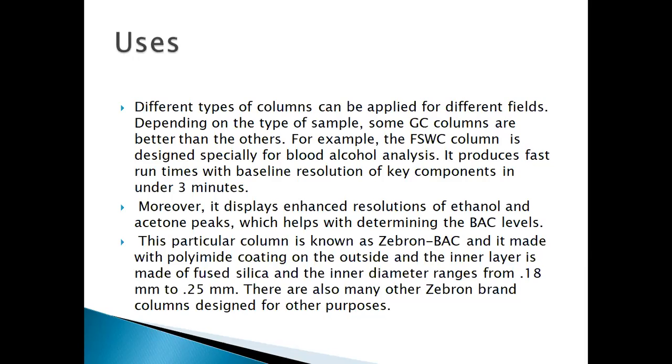Moreover, it displays enhanced resolution of ethanol and acetone peaks, which helps with determining the BAC level, the blood alcohol concentration level. This particular common column is known as Zebron BAC and is made with a polyimide coating on the outside, and the inner layer is made of fused silica, and the inner diameter ranges from 0.18 millimeter to 0.25 millimeter.